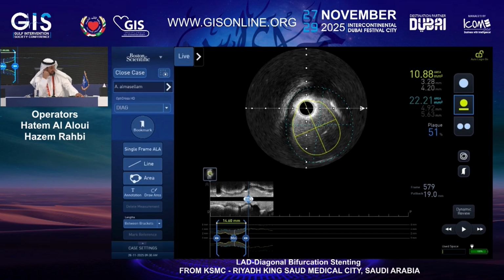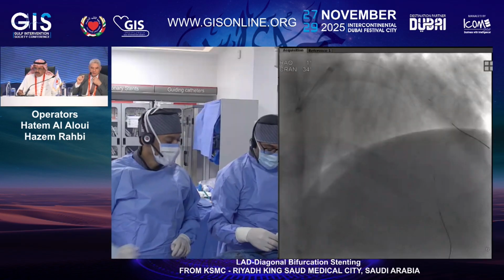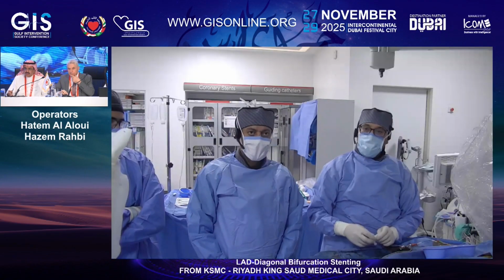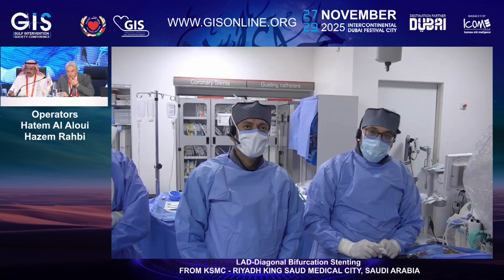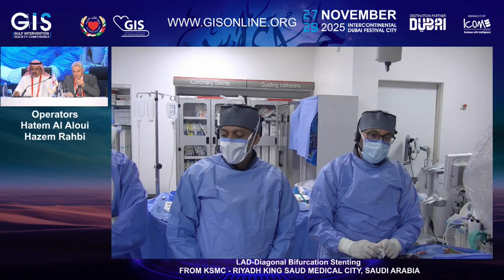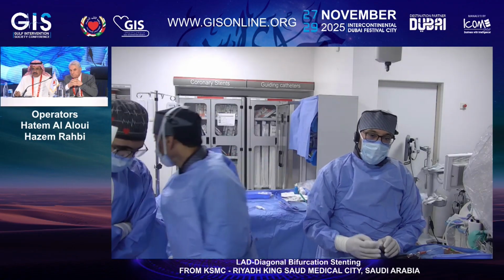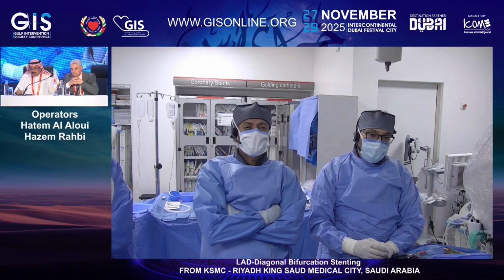Dr. Habib: Just a question to the operators. Will this IVUS finding change your strategy, and how? It will support our first initial plan, actually, but it will be very helpful for us in choosing our equipment, the diameter of the balloons that we will need to apply, the length of the POT balloon.